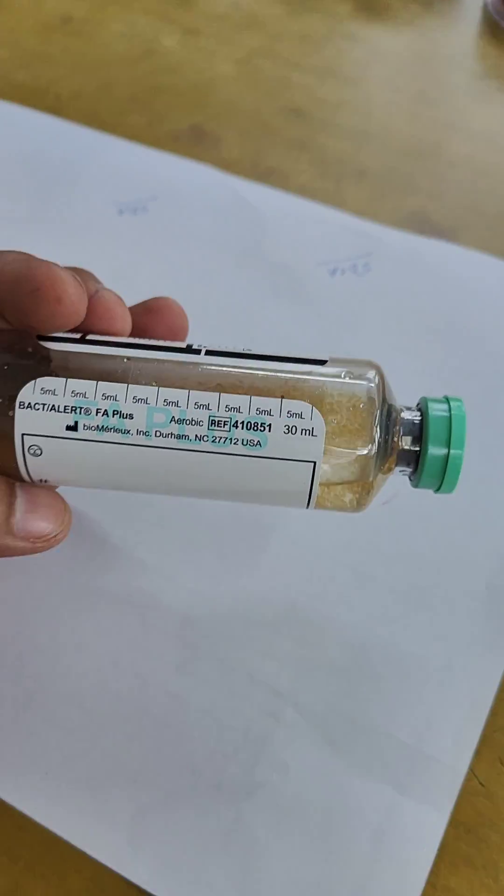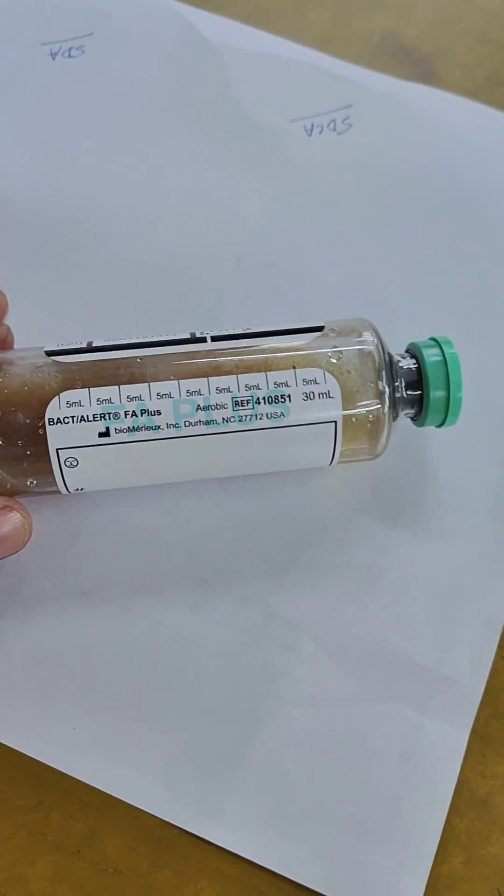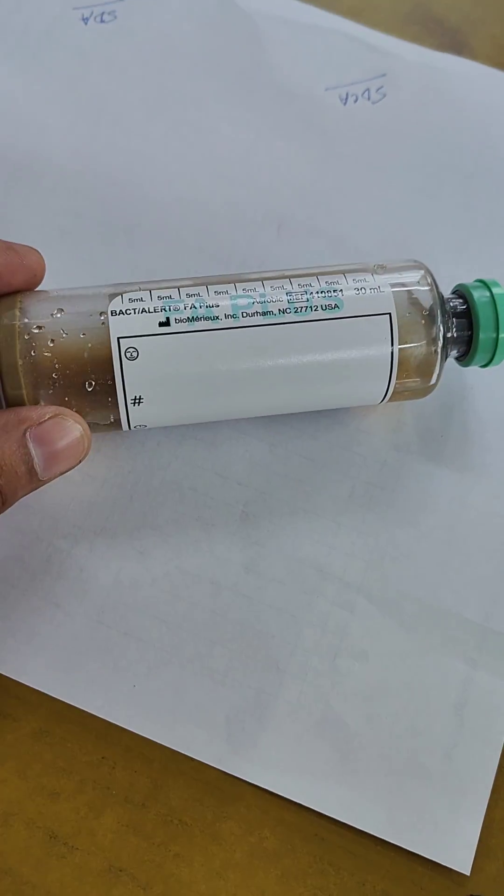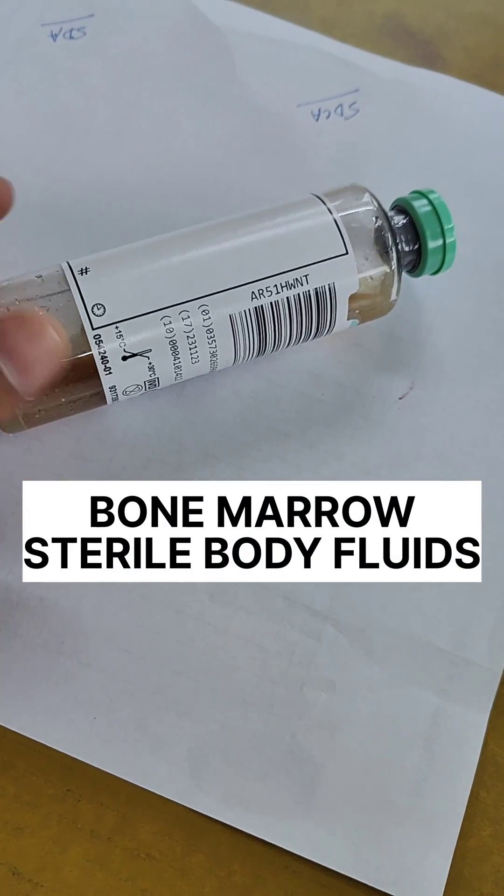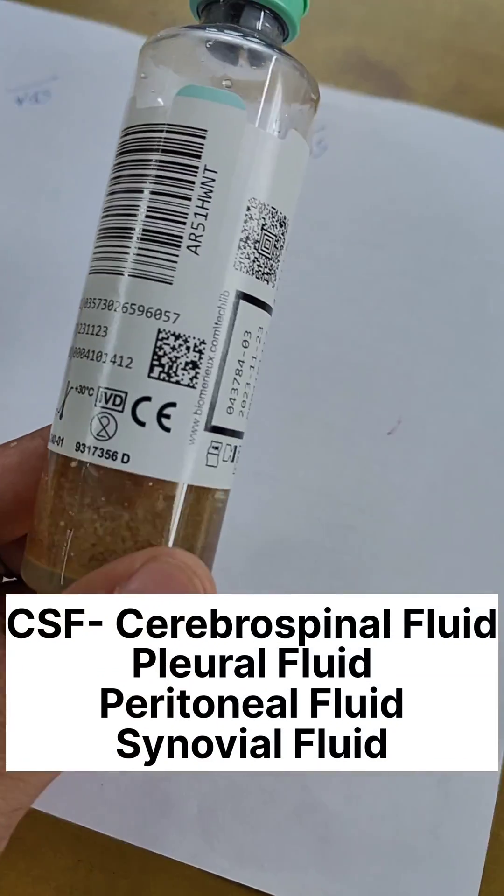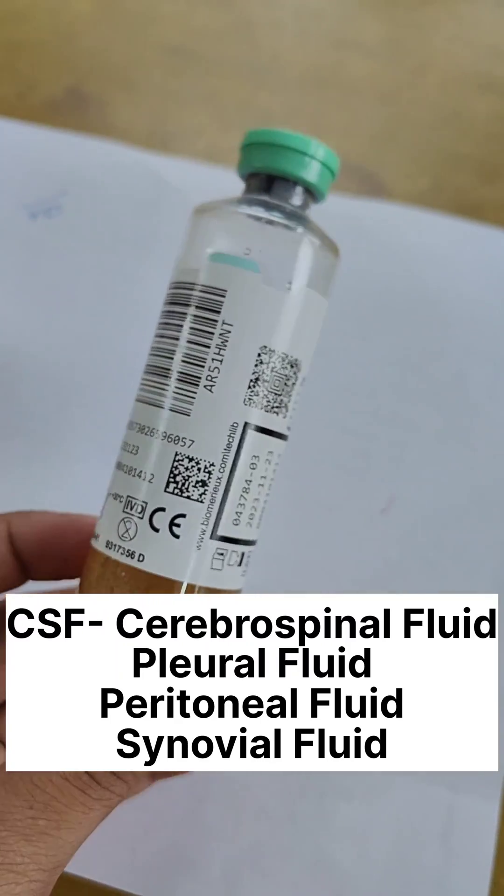Other than blood, this bottle can also be used for culture of bone marrow and sterile body fluids like CSF, pleural fluid, peritoneal fluid, synovial fluid, etc.